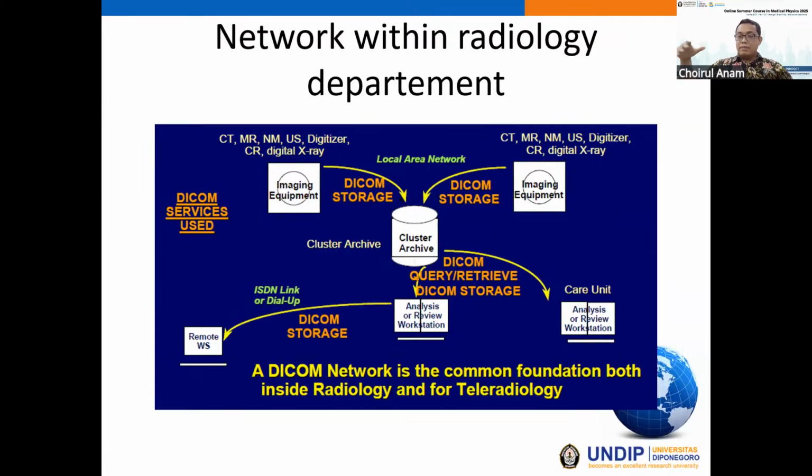The images from specific modalities should be stored in the cluster archive, and then they can be used and analyzed remotely, for example, by a physician in another location who obtains the image from the archive like this.